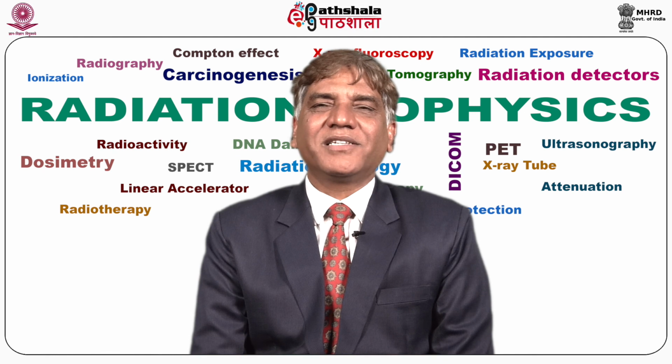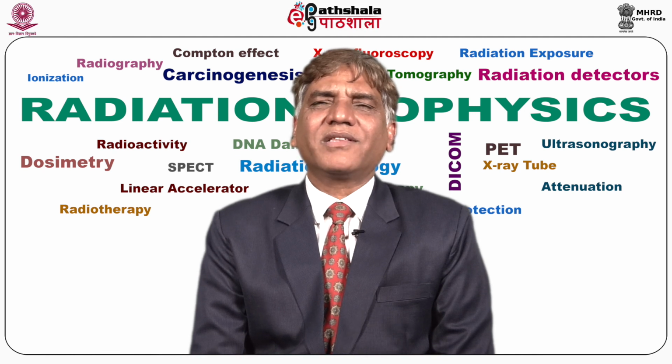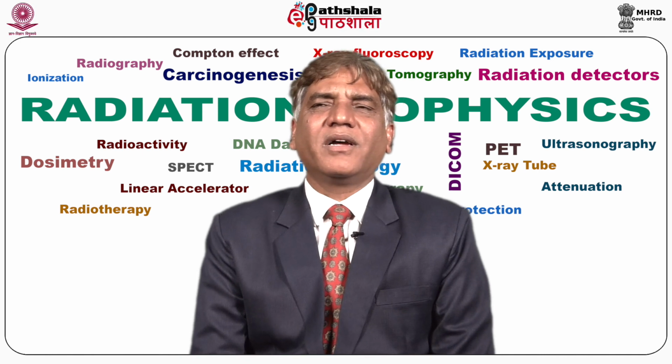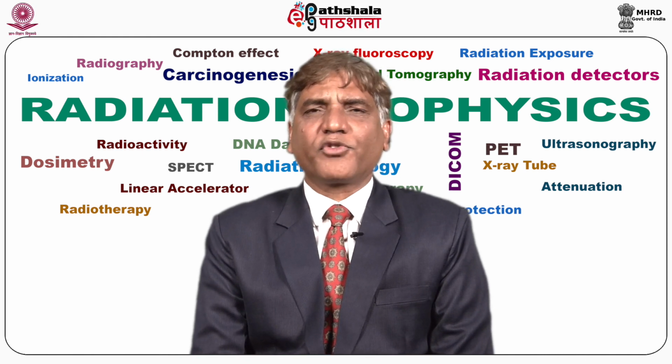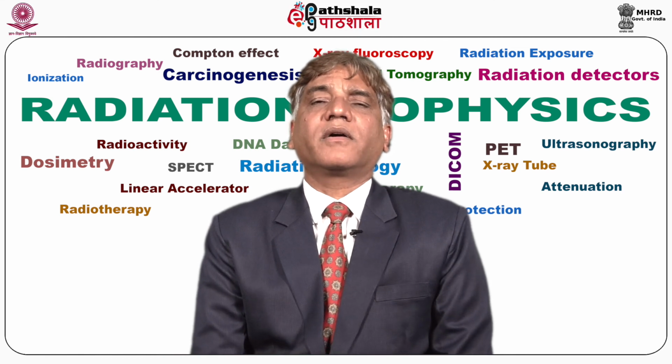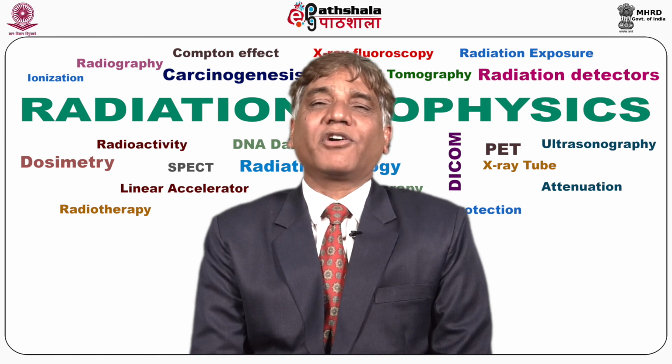We have the dual energy CT scanners. So all these CT scanners are utilized. They perform better Z-axis resolution, better image contrast, and image resolution is very much improved with a minimum scan time. So it provides different three-dimensional post-processing techniques that can be used to further add to the diagnosis of soft tissue pathology.